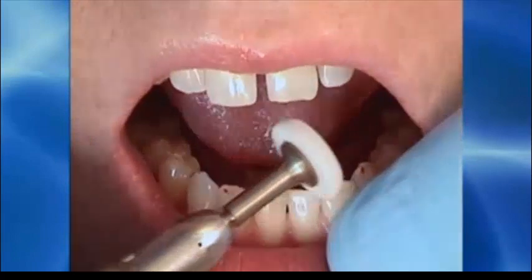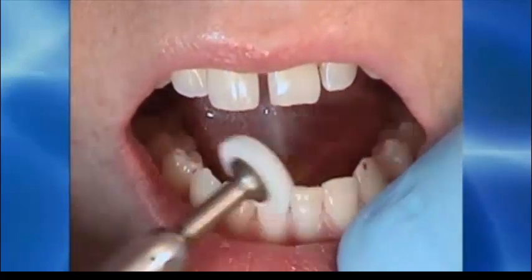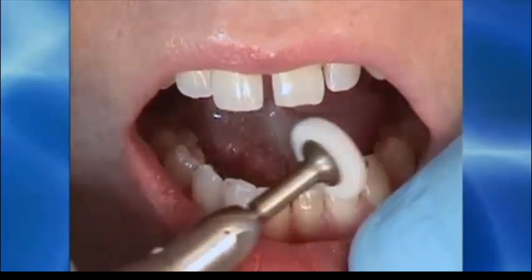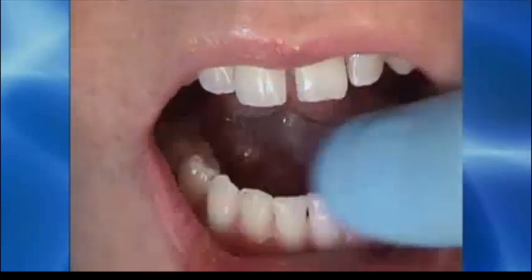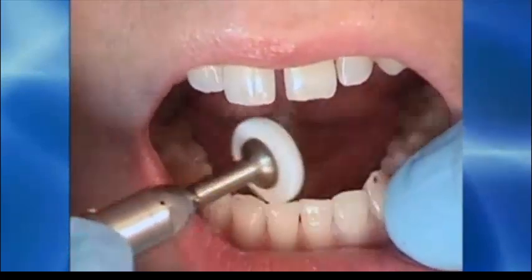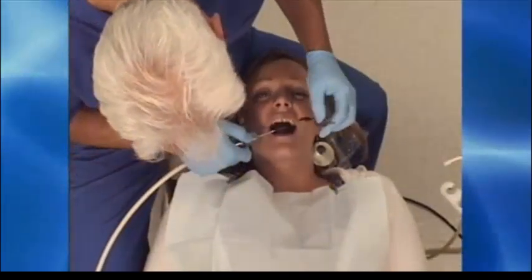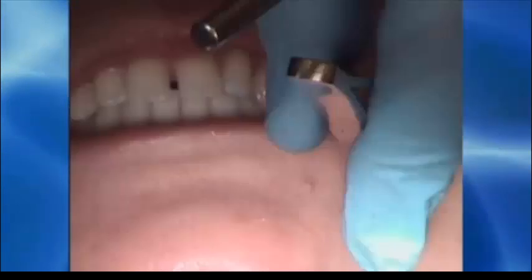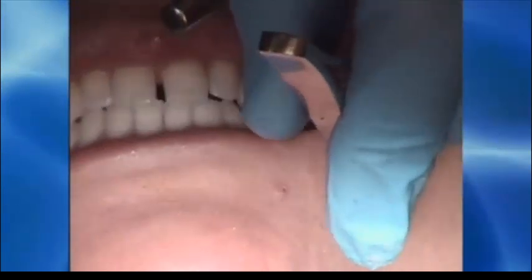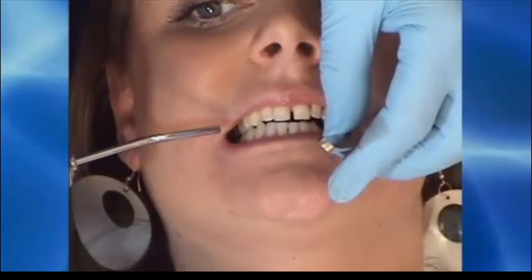And then for patient comfort, it's important to polish the incisal edges and smooth away any graininess. And these rubber wheels do an excellent job of smoothing enamel or porcelain. You can see I'm lightly dusting the edges and polishing back towards the incisal. So here I'll air dry the teeth again and place the paper on the patient's left side and have them repeatedly move to the right as I try to locate the contacts on the upper and lower left that are prolonging the disclusion.